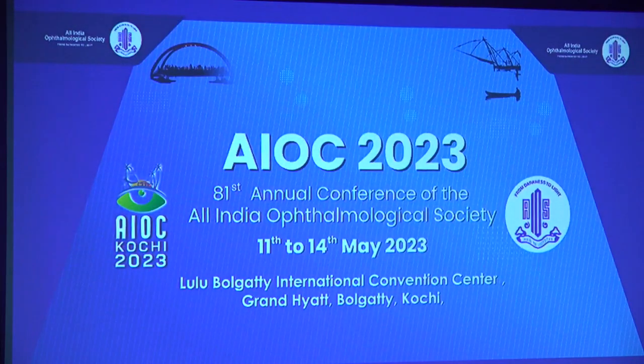Thank you, Dr. Jatinder, for the comprehensively covered presentation. Just like asepsis, hemostasis is also a very comprehensive approach. You have to take care of everything, right from your perfusion pressure, leaking ports, and your infusion temperature, and all the things, and then only you can get the best possible hemostasis. So I think we are open for questions. Dr. Reddy, your take, what extra do you do in your practice to ensure you get good hemostasis?